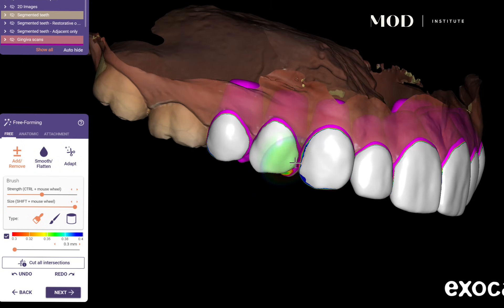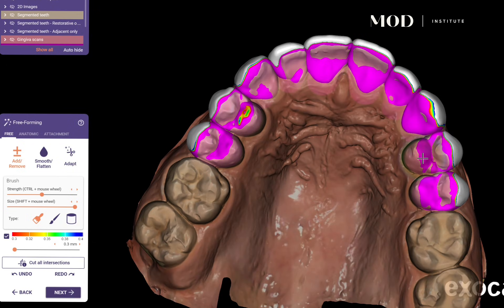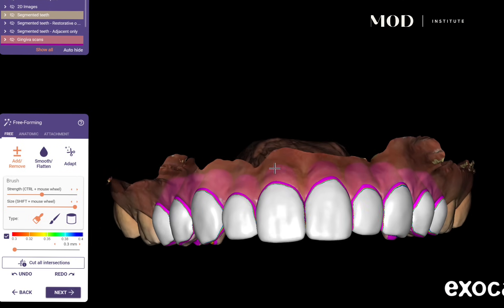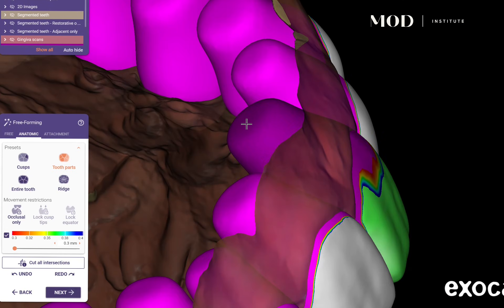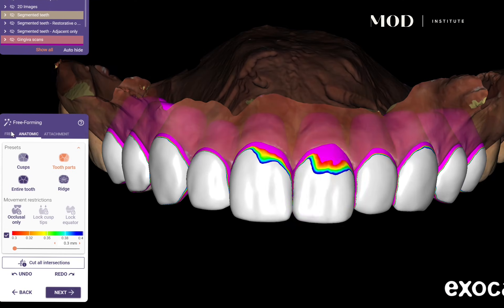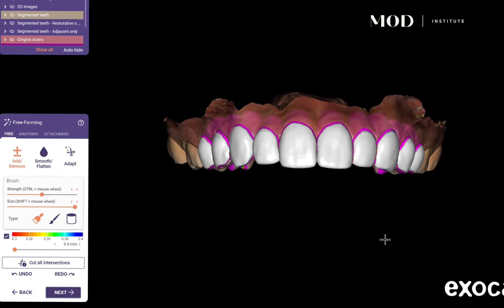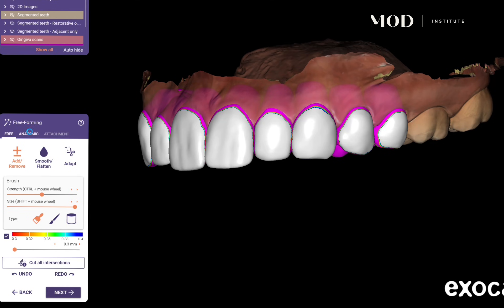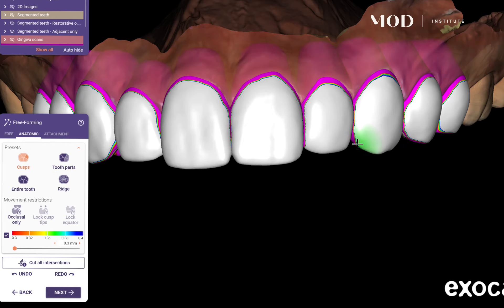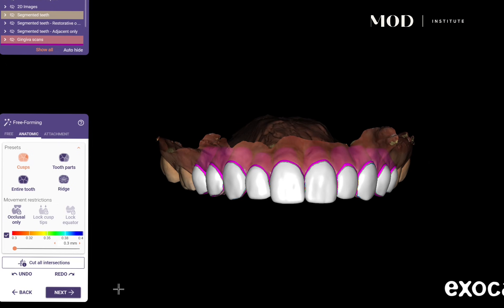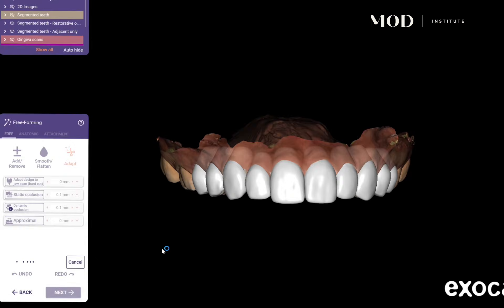On the lingual I'm making sure that I have all pink, which means it's going to be cut away and not interfering with occlusion. I'm checking my cervical area to make sure I'm not doing any artificial crown lengthening and looking at the natural sulcus of where those teeth are. The patient had a blunted cuspid, so I'm going to give that a little bit more contour right there.